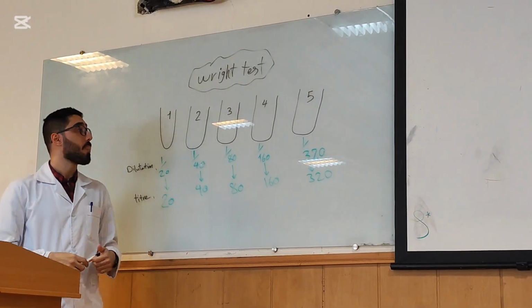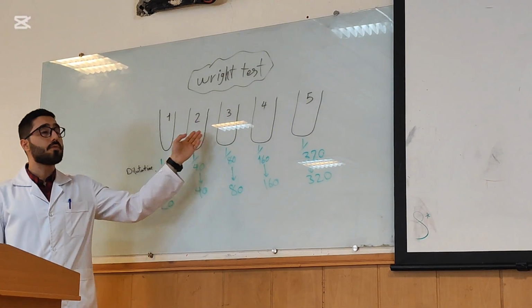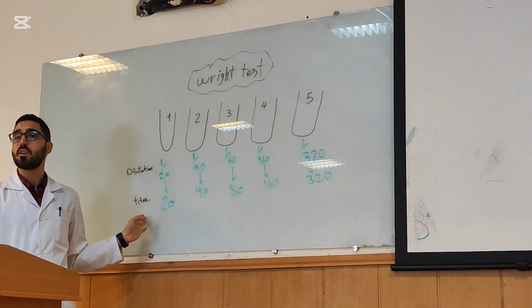In your exam, in each rack, you see 5 tubes with different dilution and different titer.